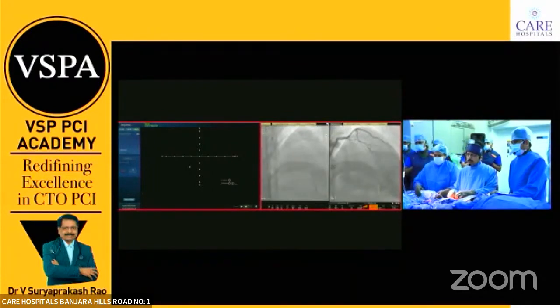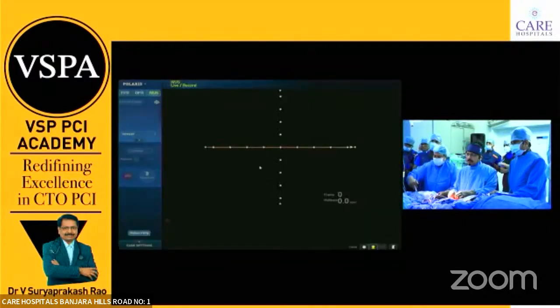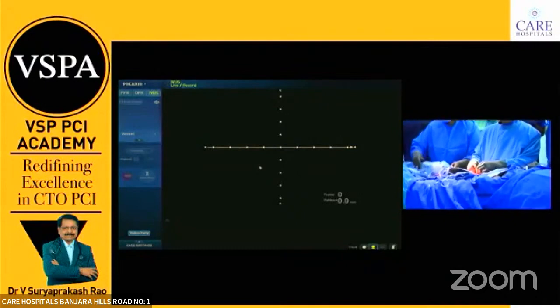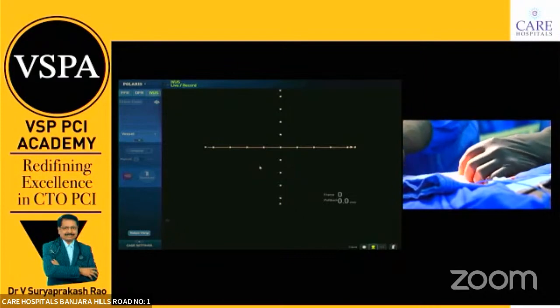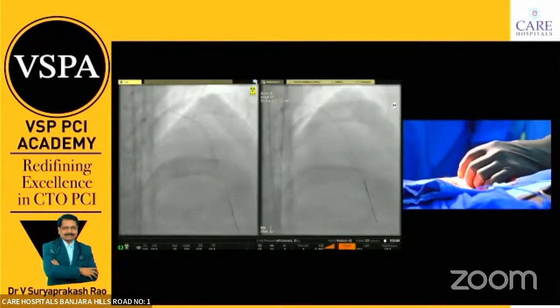So my distal marker has crossed the middle marker. I want the vessel's distal portion also, which is very important, so I want to go as distal as possible. Maybe that's enough, I think. Okay. Yes. The auto pullback started.